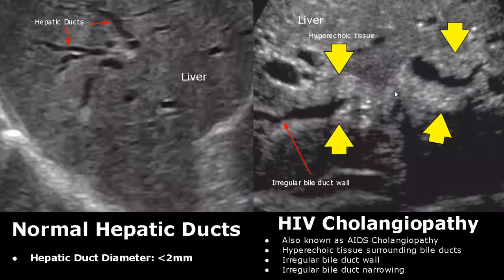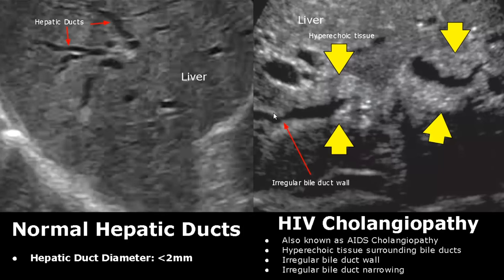HIV cholangiopathy, or AIDS cholangiopathy, is seen in AIDS patients. Hyperechoic tissue is seen around the bile ducts, and the bile duct walls are irregular. There is also irregular bile duct wall narrowing.